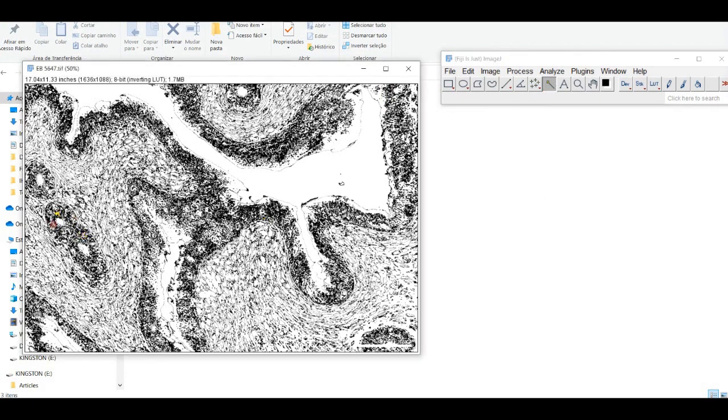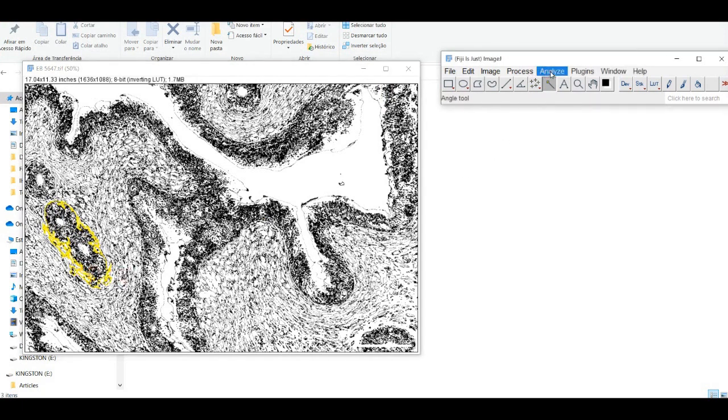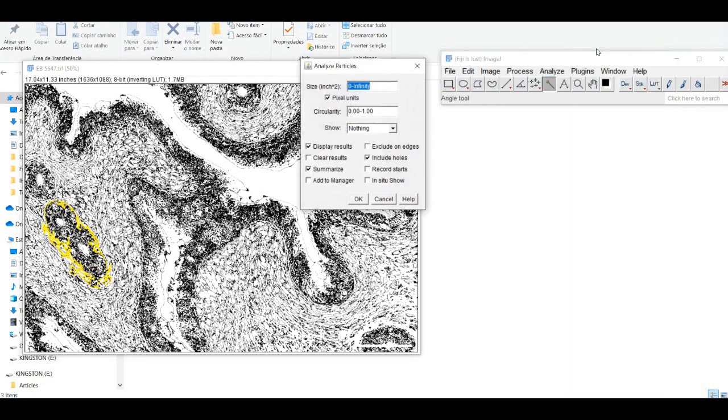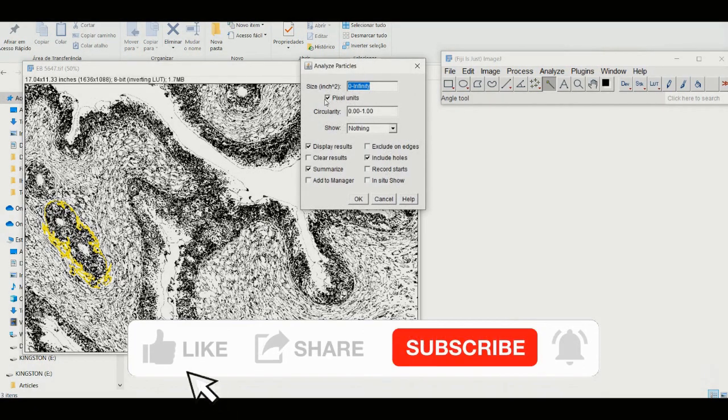Please note that the result should be interpreted with caution as the intensity of the stain may vary due to different conditions during staining, fixing, washing, and also due to the individual variations on the tissue.